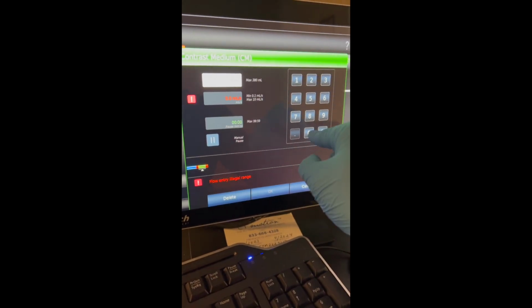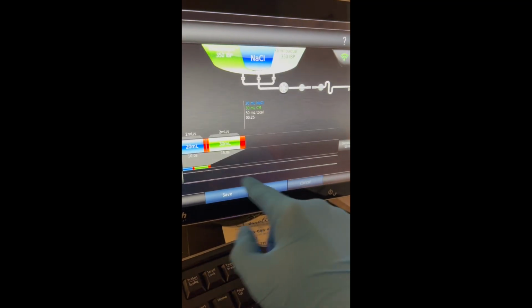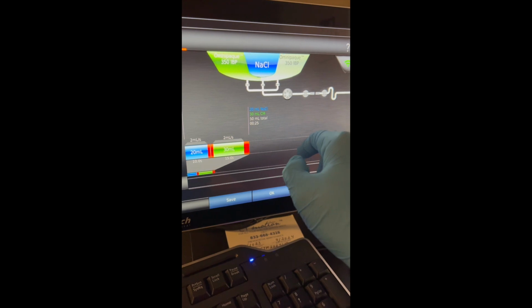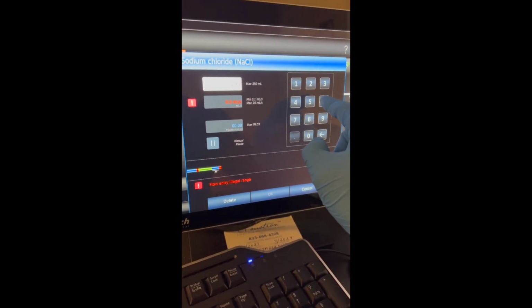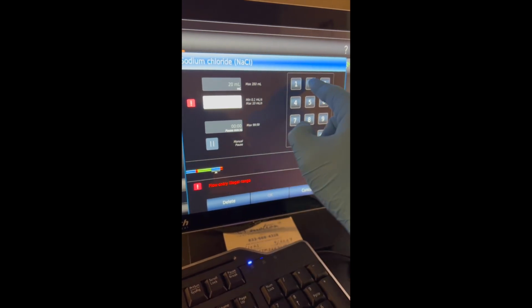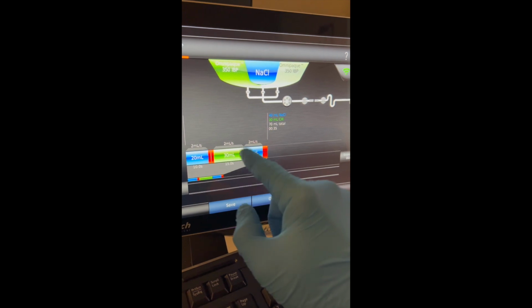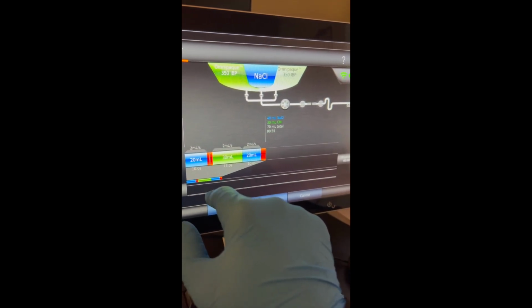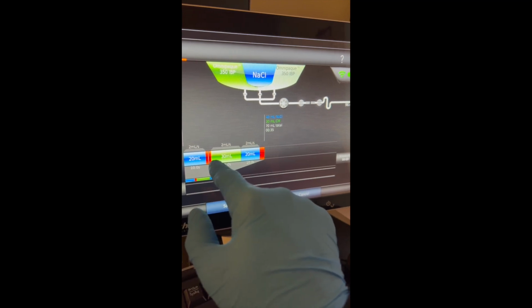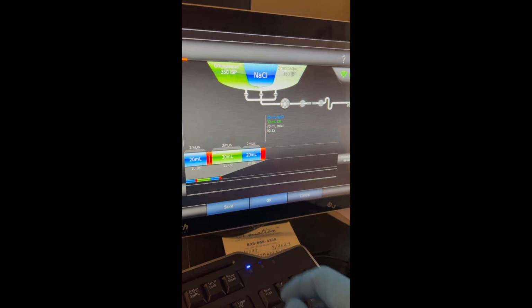And then when you type in your contrast, it'll keep that bar there. Now if you don't want the pause, then you can just go straight on to your saline. And you see there's not a bar there. So that bar is going to mean a pause. This means after the 30 milliliters are done, it's going to go straight into the saline flush.